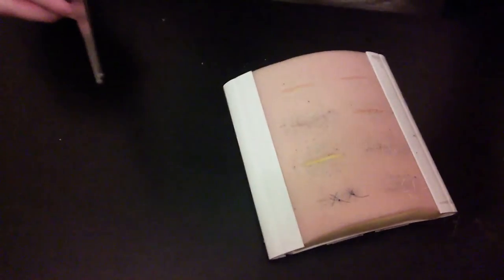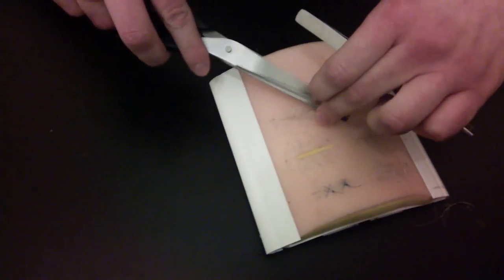We're going to take the scissors and cut it so there's about a centimeter left. And that is how you do a Lambert inverting suture.